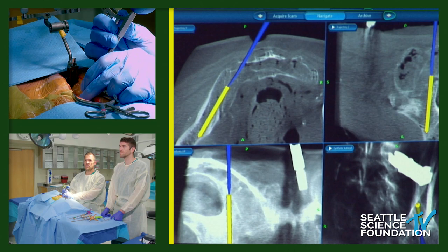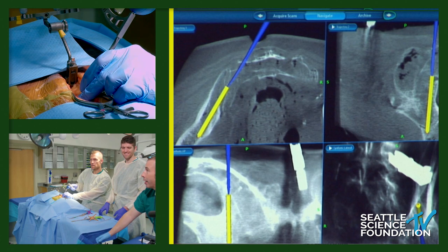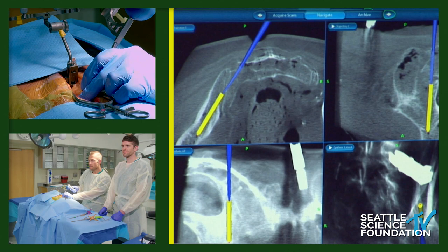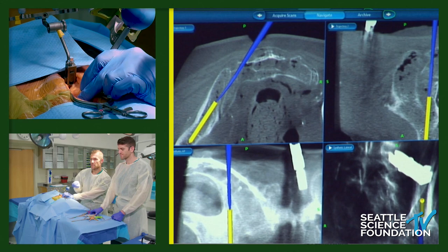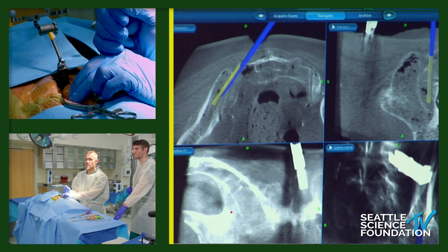I've hit the SI joint and will use a mallet to advance. I'm making sure I'm superior to the sciatic notch, as far ventral in the SI joint as this approach allows, and aiming toward the cortical segment of the ilium just above the acetabulum. Once into the iliac bone, it's typically much less dense and you can advance quite easily — but be careful not to accidentally plunge too deeply. Engaging the outer cortex of the ilium is actually desirable, as it involves another cortex and strengthens the fixation.